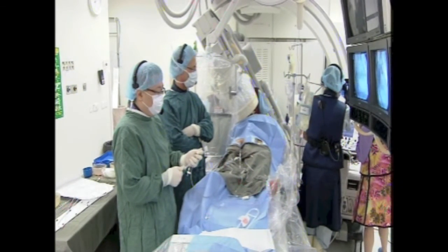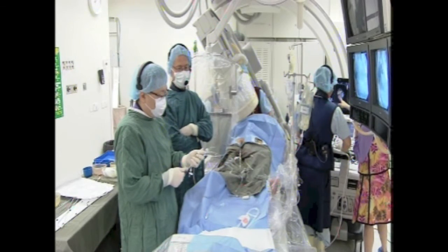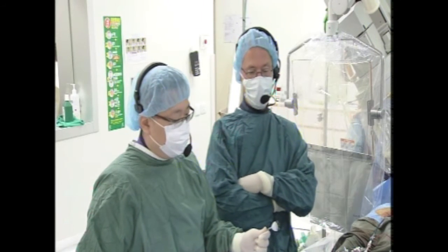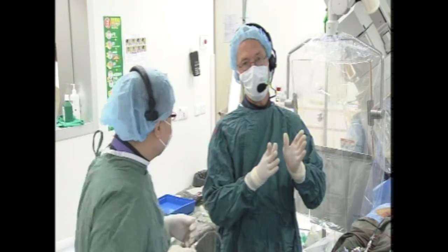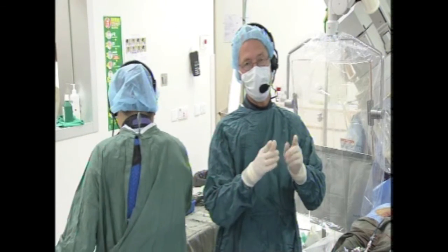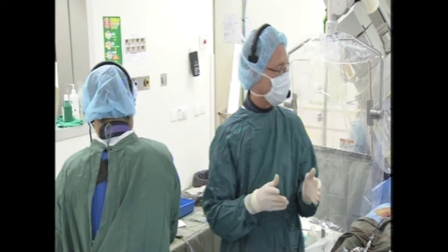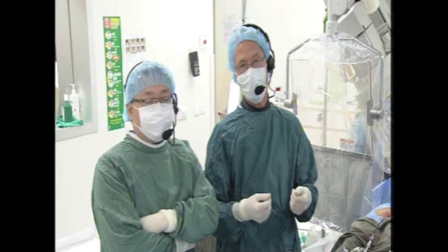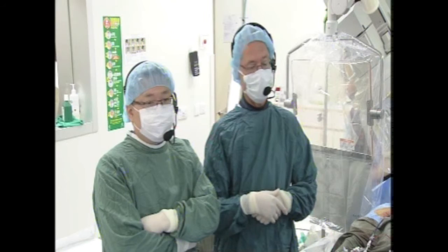So if there is still persistent leak, then there's no other choice but to deploy this. If that happens, and it happens actually more often when you have a distal bilobe LAA with a small lobe, and you have the anchors in the small lobe, then it happens more often. And if that happens, you should not pull, because then you actually can rupture the appendage. So then it's better to deploy.